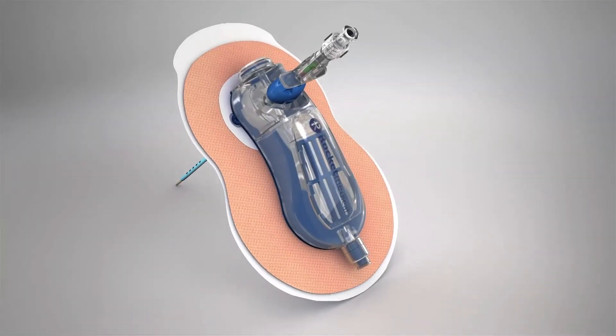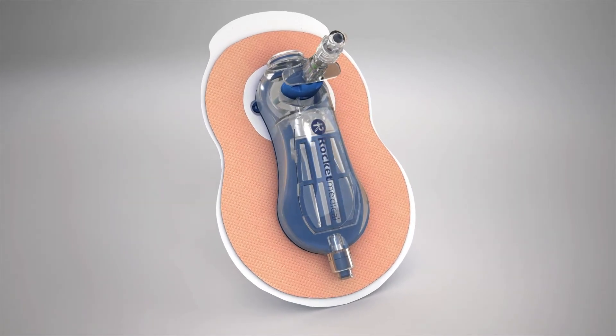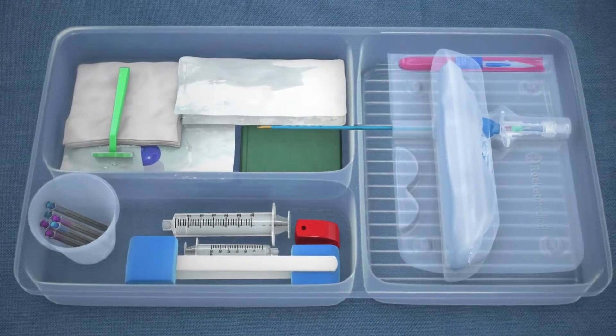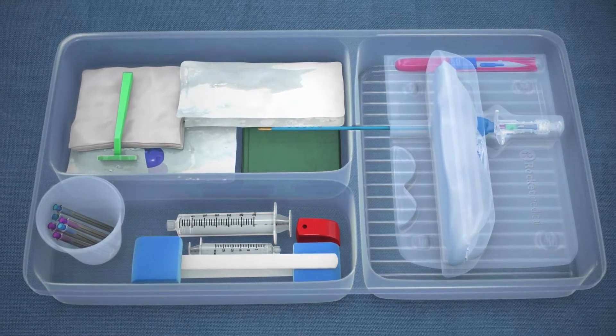The Rocket Medical Plural Vent has been designed for the ambulatory treatment of spontaneous and iatrogenic simple pneumothorax, and comes with a procedure tray with the required components for the insertion procedure.